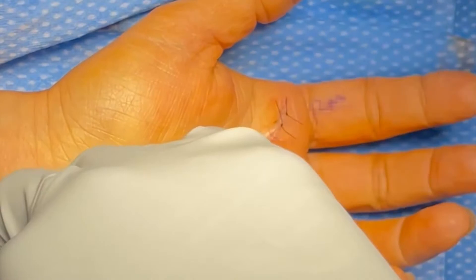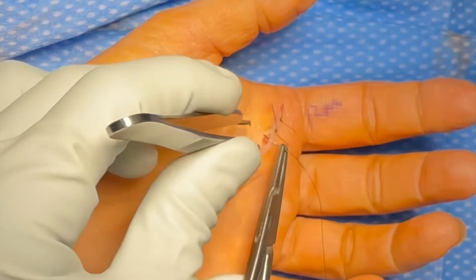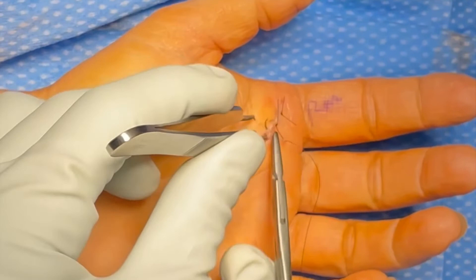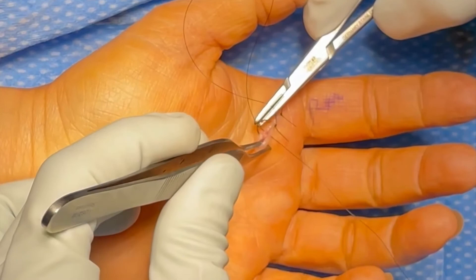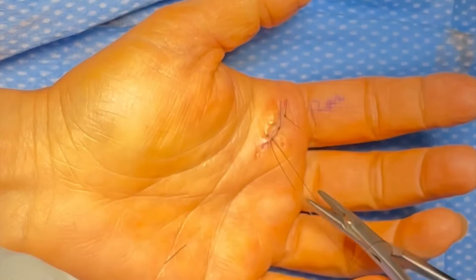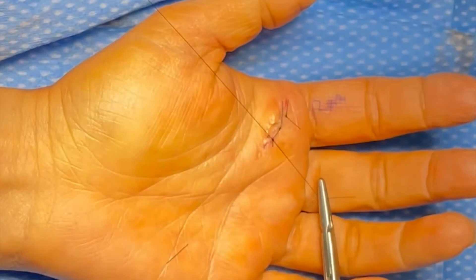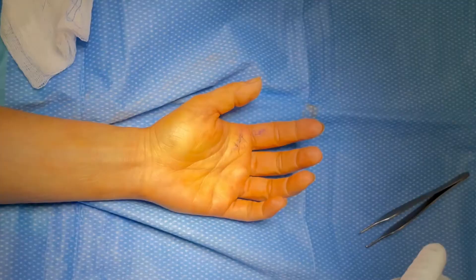Notice the good technique of cutting the suture with the very tips of the scissor. You do not want to cut sutures with the back part of the scissors, because you could be concentrating on the proximal end and not realize that you're cutting something important — such as an artery or nerve — with the tips. This is called 'passing point' and is a break in good technique. It is good practice to maintain this habit throughout surgery so that when you're dealing with nerves or arteries in more dangerous parts of the procedure, the habit is ingrained.